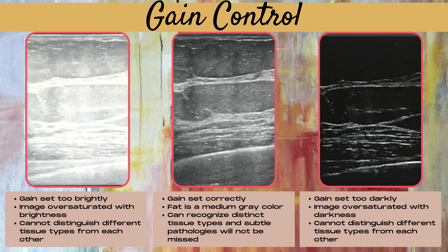Now let's look at some ultrasound images for examples. Today we're using an ultrasound image of breast tissue. In the first image on the left-hand side, the gain control is set too brightly and the image is oversaturated with brightness, and you cannot distinguish different tissue types from each other.